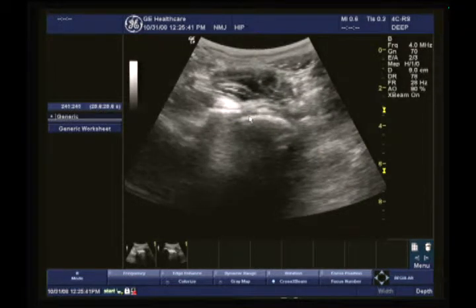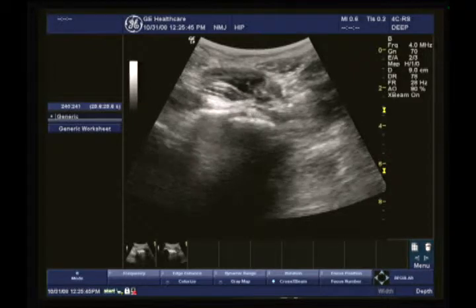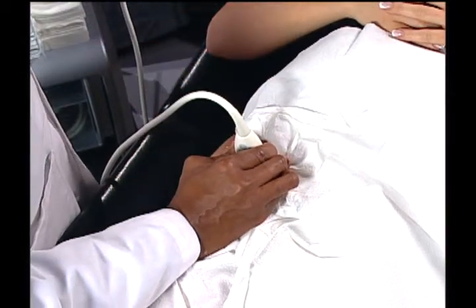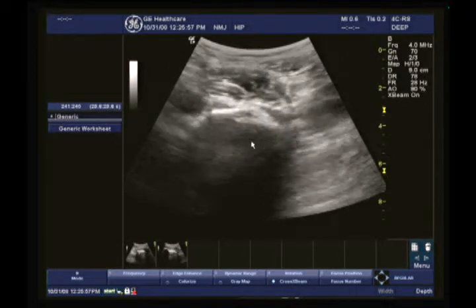Other deeper structures, sometimes physicians are wondering about if you're going to get into the neurovascular bundle. That area is a lot more medial than where we are over the hip surface, so there's no concern in actually hitting blood vessels or nerves when performing needle guidance.